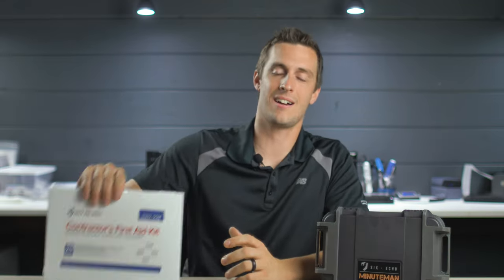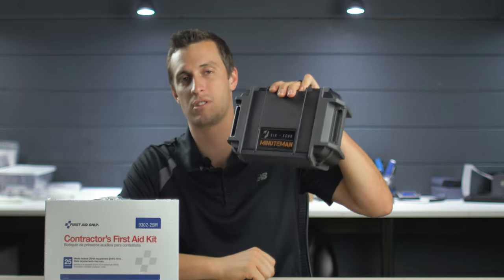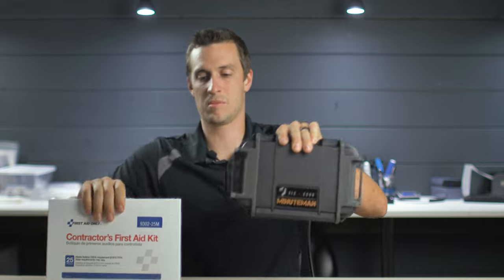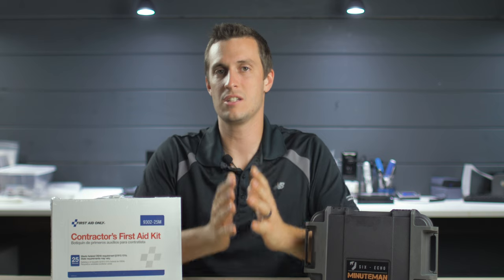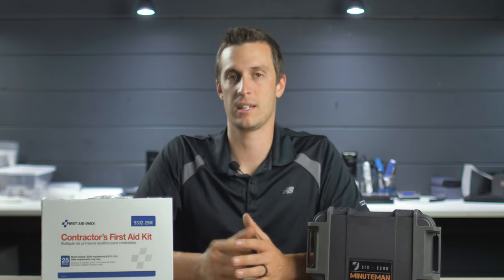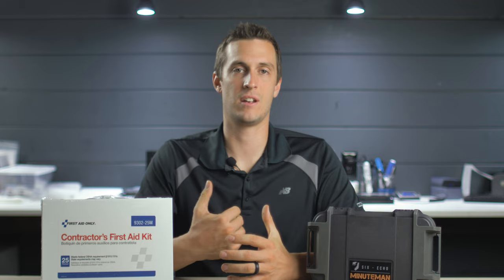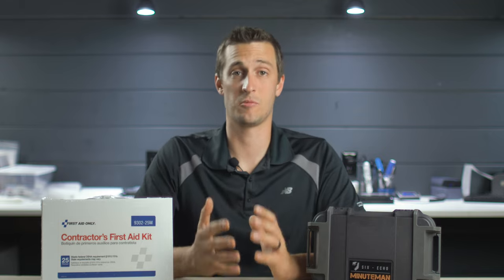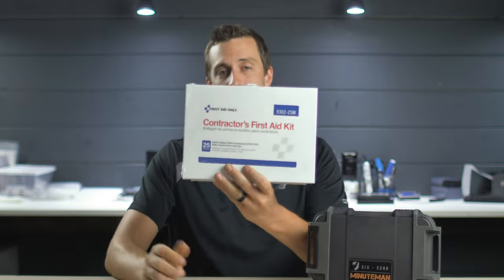Today we're going to take a look at a contractor's first aid kit that I bought off Amazon and compare it to our Minuteman first aid kit, which is roughly the same size as far as the case goes. We're going to take a look at these two and figure out what's inside each one, what's really going to save a life, and which one is more valuable. The old saying goes you get what you pay for, and that is absolutely right when it comes to first aid kits. A lot of people tell me my kits are too expensive — even a $30 tourniquet is too expensive — because you can buy an entire first aid kit for $30, and that's about what I spent on this one off Amazon.